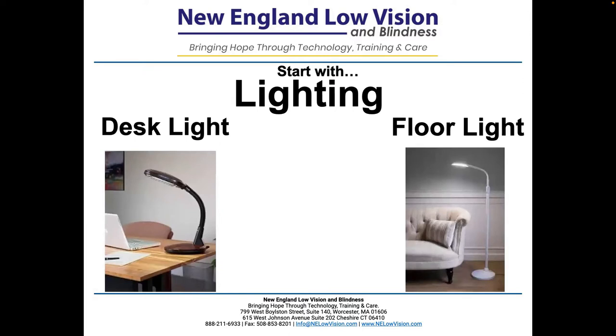Two of the more popular ones, I'm going to mention these two. You see them on screen. One is Verilux, the other one is Stella. So these two lights, one's a desk light, one's a floor light, are very popular in New England. I imagine they are throughout the country. Are they the only ones? No, they're not. I bought them both for myself to try them out, and I use them both. I have a desk lamp near a chair and next to a bed, and then I have the floor lamp next to another favorite chair.